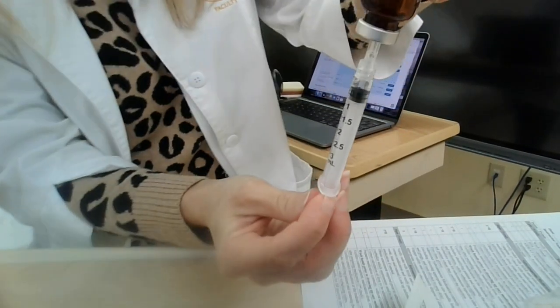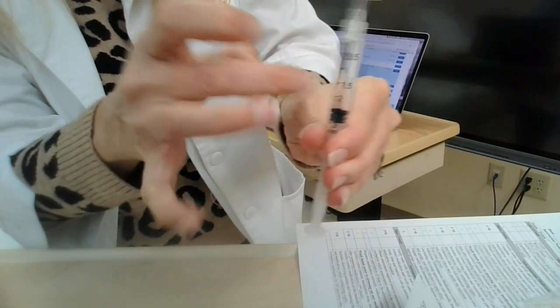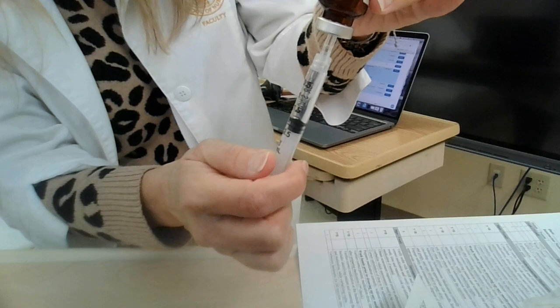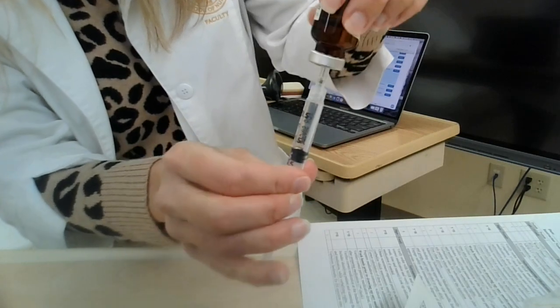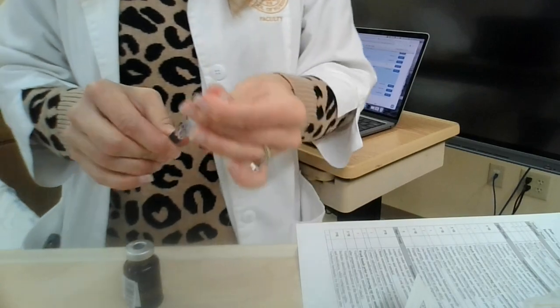Okay, we're going to go ahead and draw back. If I have any air, you're going to flick it to the top and push that air back in. You can only do that when you're still in the vial. Okay, so I've got my 2 milliliters, and now I'm ready to do check 2.